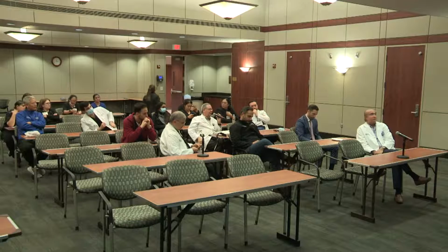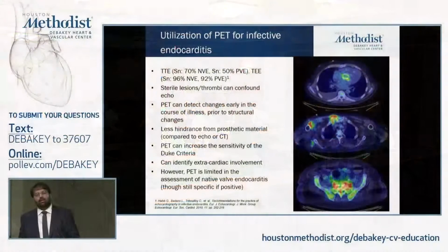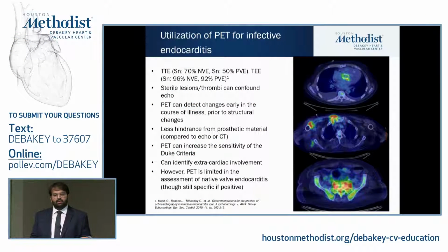So, yeah, that's true. The PET just confirms it and makes it a lot easier to do it. But yes, that's a good point. You're right. In this case, perhaps he would have been followed up or treated in the same way. But as you said, this added a layer of certainty, and it also gave us prognostic information with follow-up. When we saw resolution of the uptake, we now know that treatment is at least somewhat effective. Otherwise, we might have had to wait and see outcomes. And in other cases, it might have pushed us to intervene earlier, do a valve replacement earlier, and such.